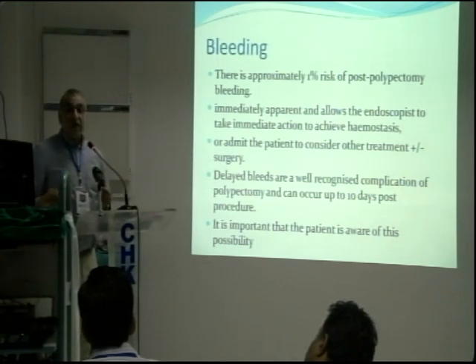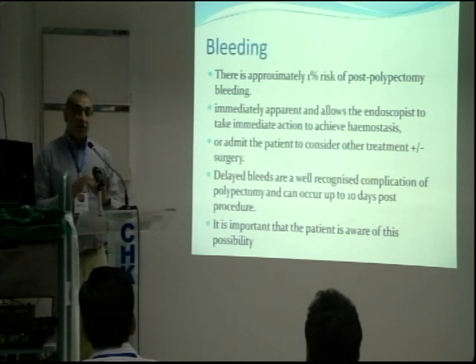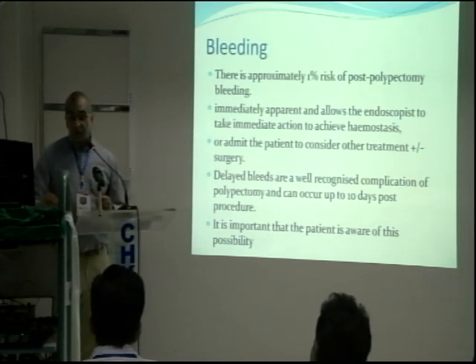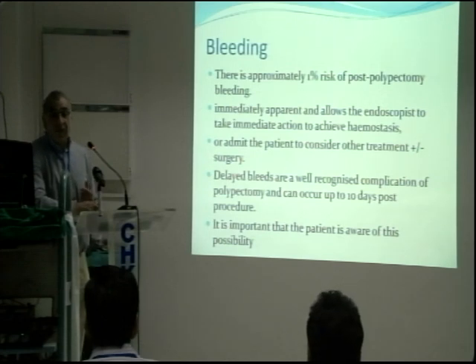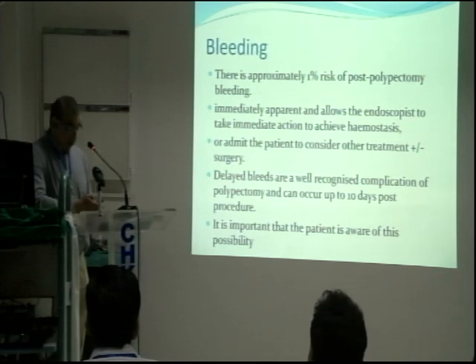Now, the problem is with delayed bleeding. It's a well-recognized complication. Whether you do polypectomy, whether you do ERCP, anything, delayed bleeding can occur any time between 2 to 10 days after the procedure. You carry out a procedure perfectly well, hemostasis looks perfectly nice, the blood pressure and hemodynamics are fine. You send them home, and 2-3 days later, or even up to 10 days later, they come in with a massive bleed. So it's important to tell the patient about it. Tell them that if they see any sign of blood, they should report immediately to the emergency department.